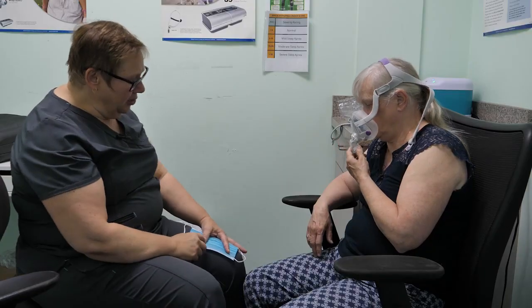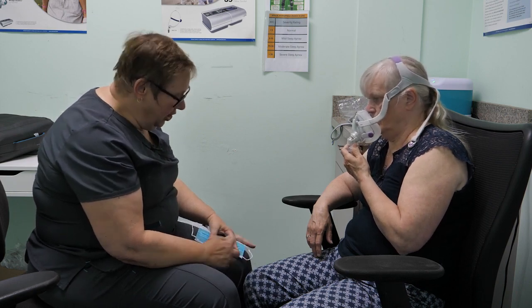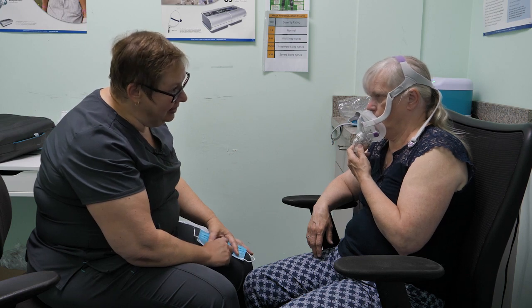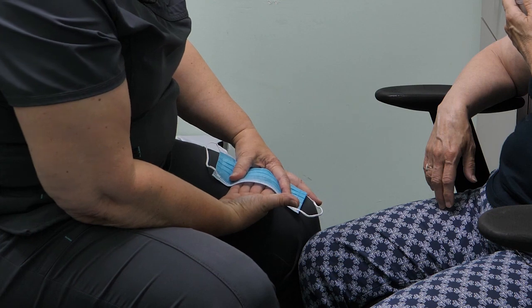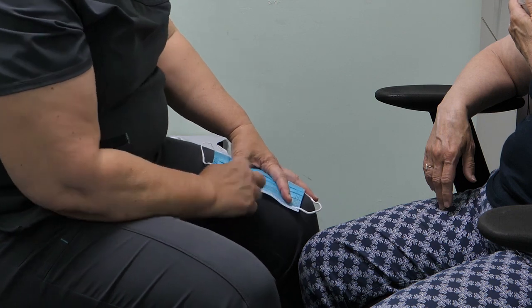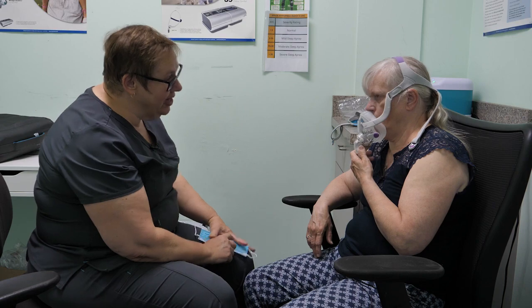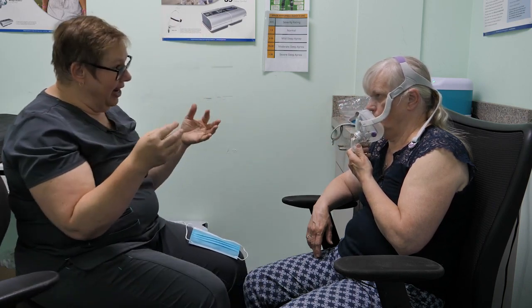So if you were to put that mask on your face right away and do up the clips, you could develop what I call micro creases in the cushion of the mask. So when the pressure comes, it's trying to fill up that mask, but it can't because those micro creases are preventing the cushion from filling. And the pressure is actually going to leak out through those micro creases. So when you feel around the mask, you're actually going to feel that air leak.